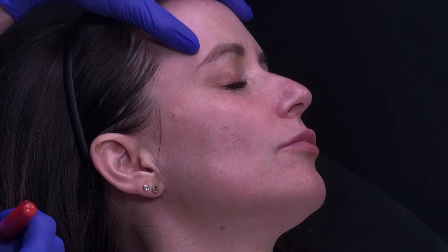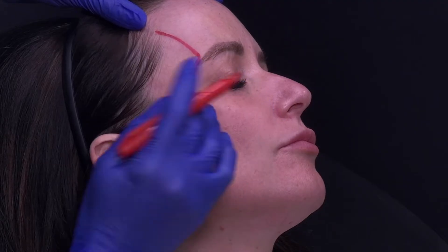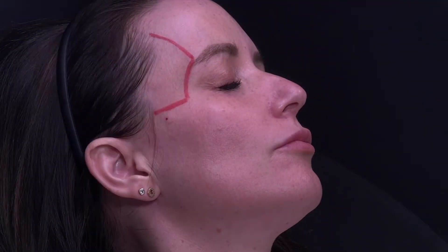My treatment area will span the temple superiorly to the temporal crest, medially to the lateral part of the orbital rim, inferiorly to the zygoma, and laterally to the hairline. Previously we would always be reticent to treat the posterior part of the temple because of the risk to the superficial temporal artery. So this is where the interfascial technique with ultrasound really shines.